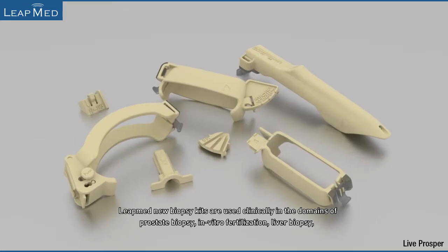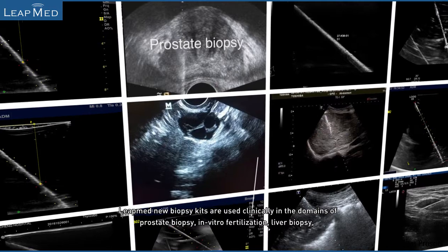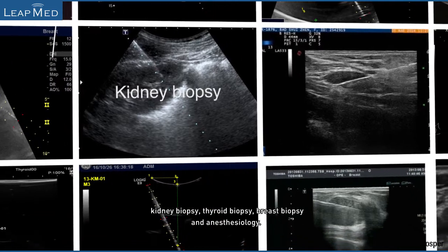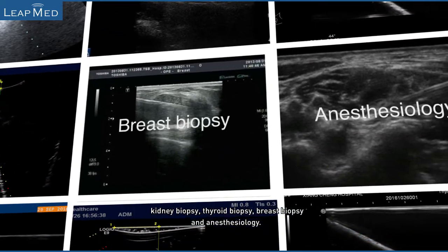LeapMed's new biopsy kits are used clinically in the domains of prostate biopsy, in vitro fertilization, liver biopsy, kidney biopsy, thyroid biopsy, breast biopsy, and anesthesiology.